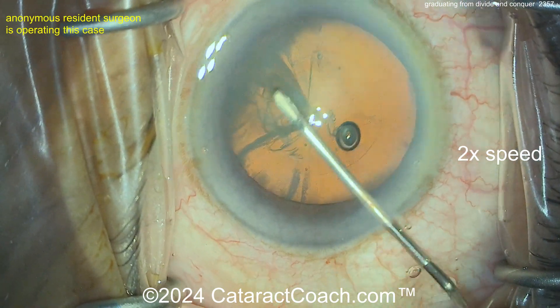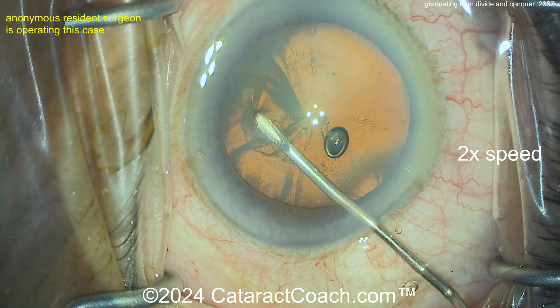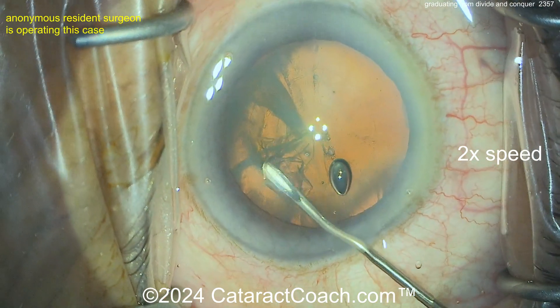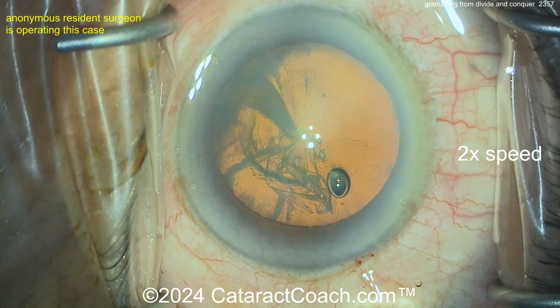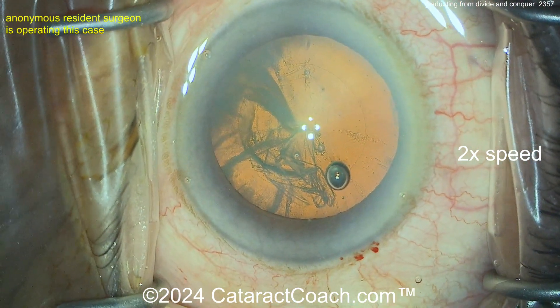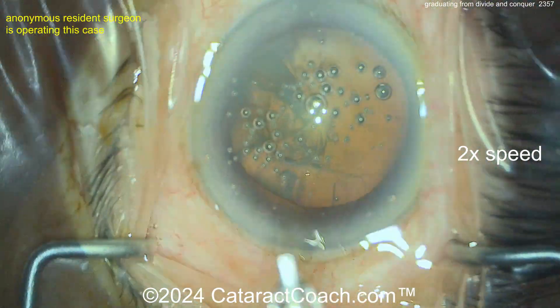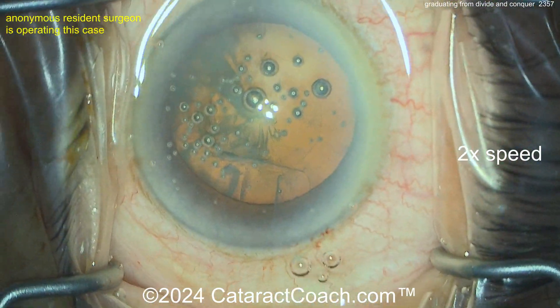I congratulate you on doing a good job. An entire rhexis with just a cystitome — fantastic! That's a good technique to learn, can be very helpful if you don't have specialized instrumentation. Just one single paracentesis-based capsulorhexis and you get the whole rhexis done — that looks fantastic, beautiful.